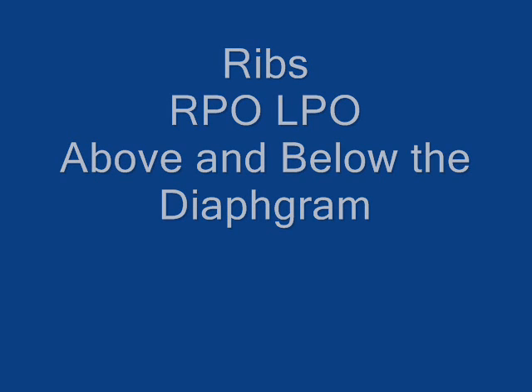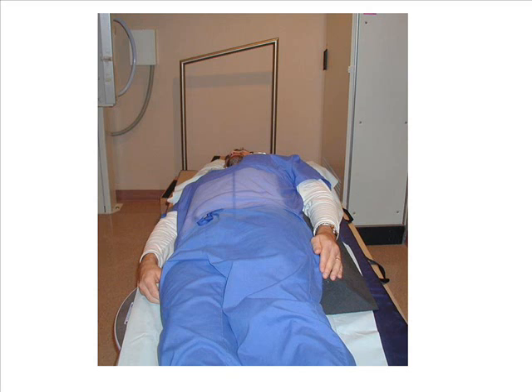Ribs AP oblique above and below the diaphragm, LPO or RPO. The patient is in the upright or supine position. Use the upright position for ribs above the diaphragm and supine for the ribs below the diaphragm.